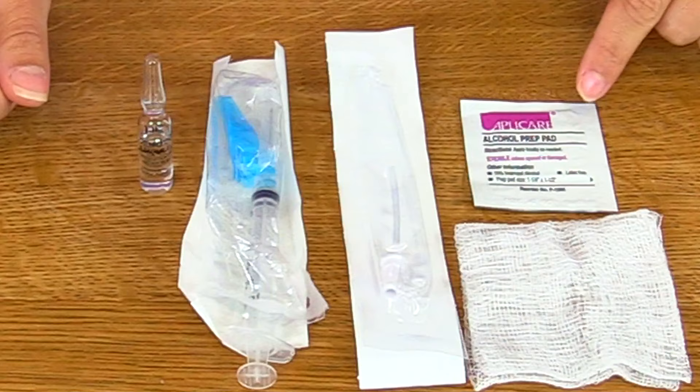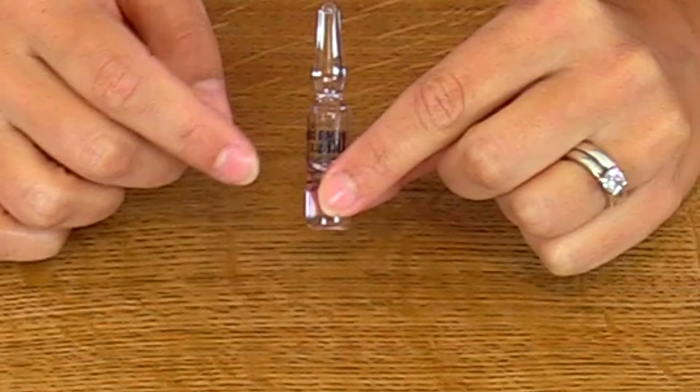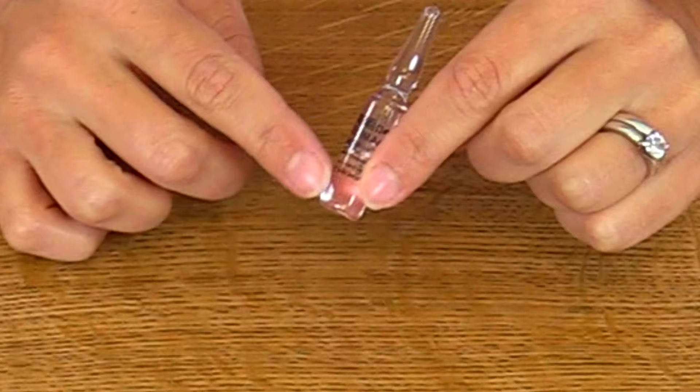First, you want to inspect the ampule. Make sure it's not cracked or has any imperfections. Also, you want to make sure that the solution is clear — it doesn't have any particles floating around in it or discoloration.